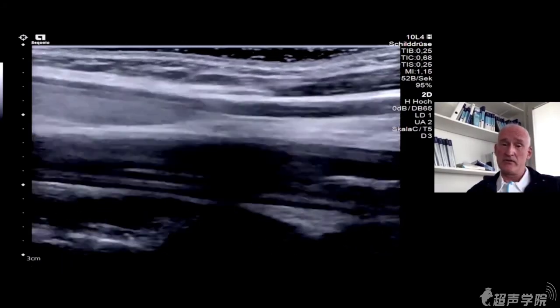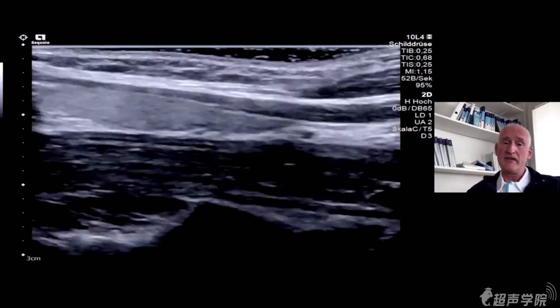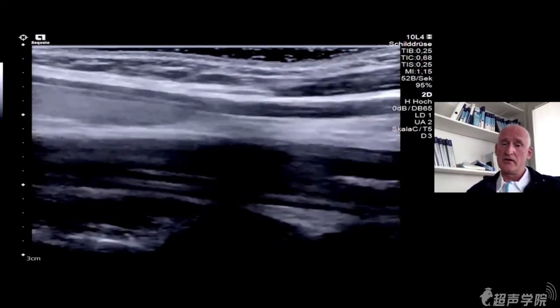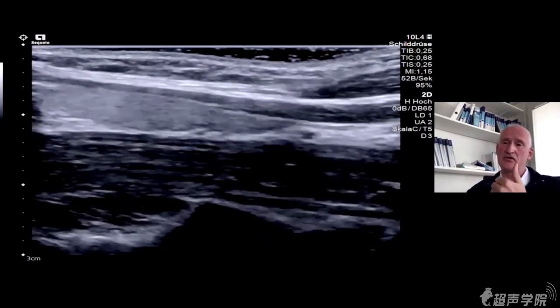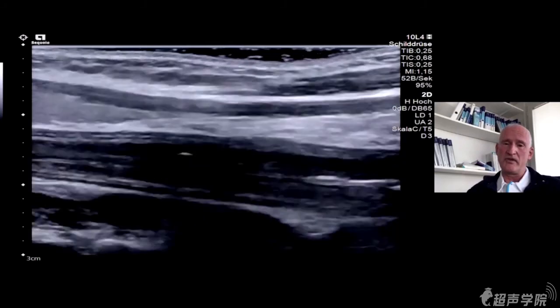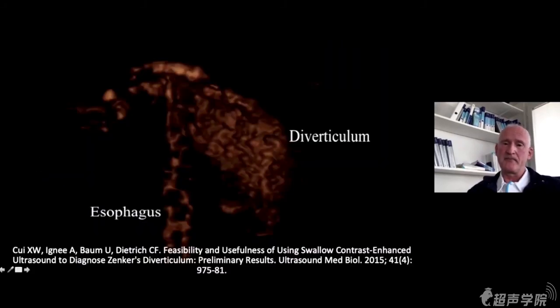So we have not only to inject into vessels, arterial vessels, venous vessels, but we can also inject or ingest into the esophagus, anus, and cavities. And this is really a promising and very exciting future of contrast-enhanced agents and their applications.